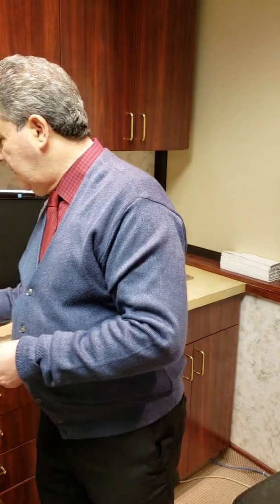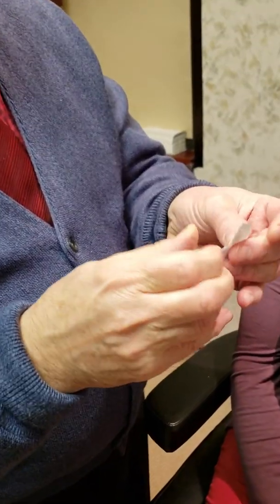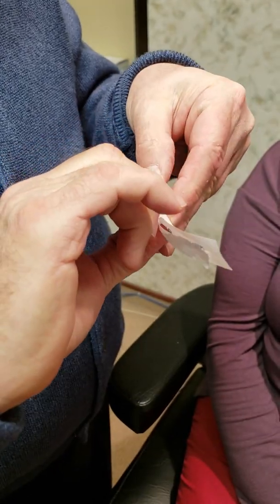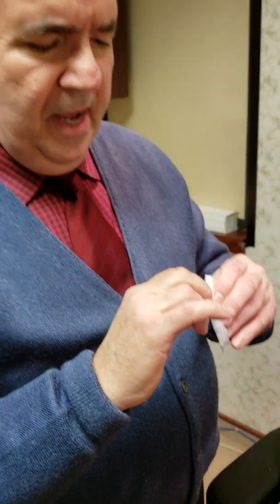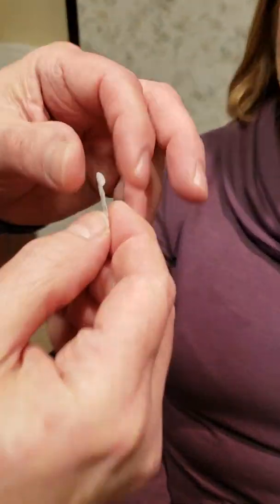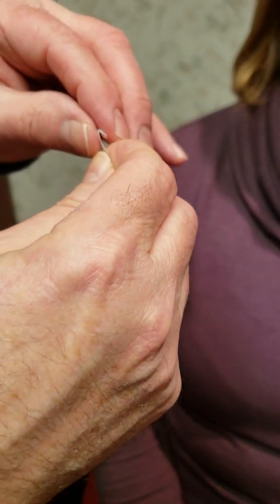Now if I were to do the other test, it's called a Schirmer test. This is an older test that's done a lot of times in research. This strip is going to stay on her eye for five minutes, which is extraordinarily long — I might end it earlier if it gets fully saturated right away. There's a little bend here and measurements on it, so let me go ahead and bend that over her lid.